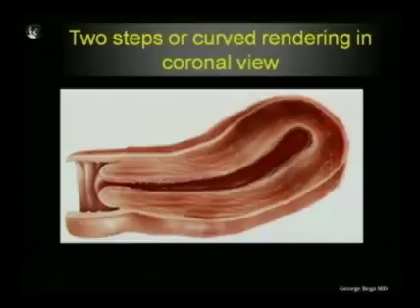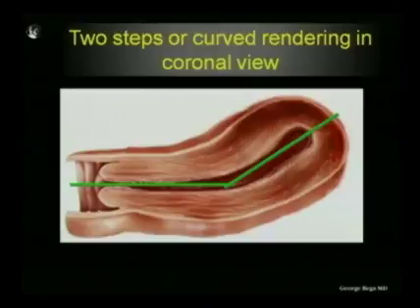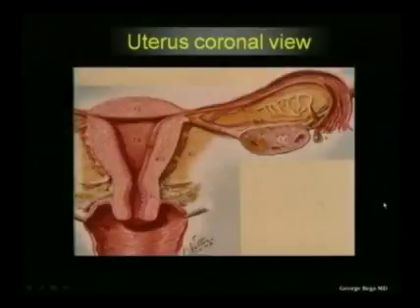Now, as we grab a volume, then the next question would become, what do we do? And typically we have access to image planes. One of the simple examples would be I grab a volume of a uterus and then I obtain either SAG, transverse, and coronal. Now the coronals are very interesting. Coronal planes are planes that are impossible with 2D ultrasound, and in the uterus, considering that it is anteverted and anteflexed, we do not have one simple coronal plane. We have more than one coronal plane. Basically a coronal plane in this case of the fundus, and another one at the level of the lower uterine segment and cervix. And this is really the end result.